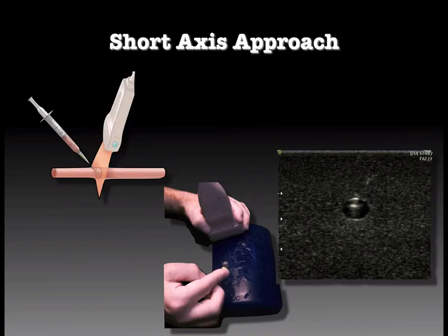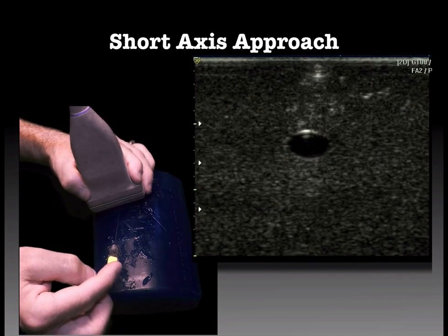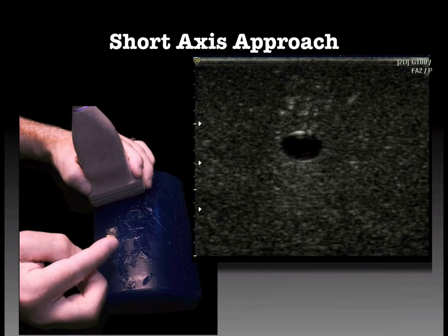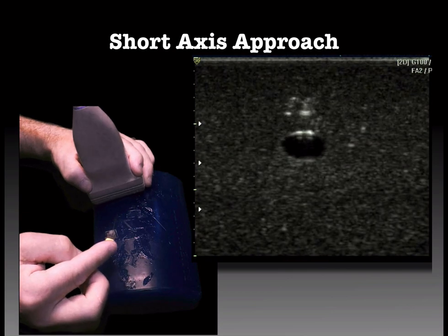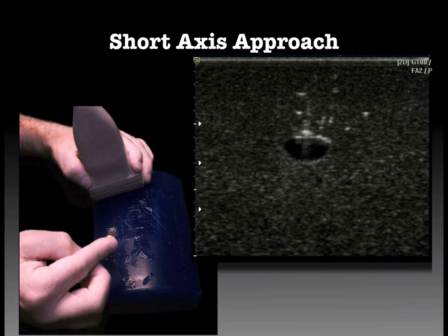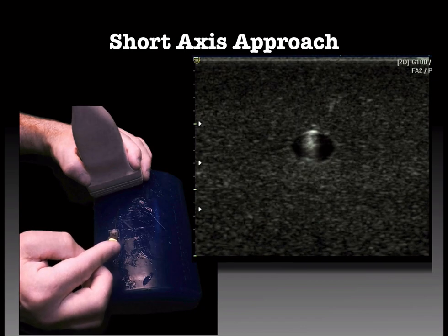So in short axis, remember the vessel looks like a circle. The needle is going to look like a dot. It's a cross-section of the needle, and we're putting the tip of the needle into the middle of the vessel. So it's like putting the bullseye in the target. Now to do this, we want to place the needle under the long face of the probe when the probe is directly over the vein. The thing is that the needle tip and the needle shaft look the same, so we want to advance our probe ahead of the needle and watch the needle pop into view. Probe, then needle into view, probe, then needle into view. That way we know we're looking at the front of the needle tip.